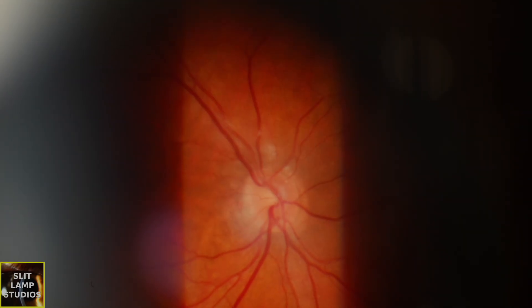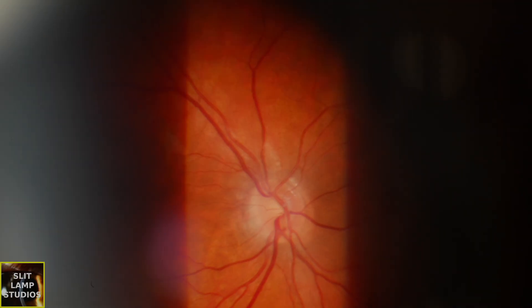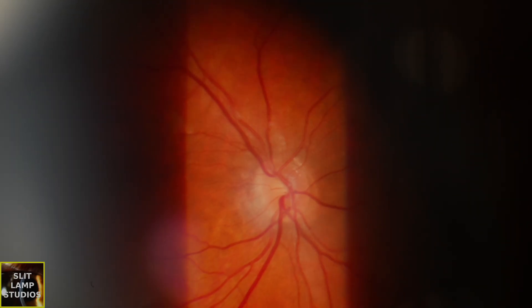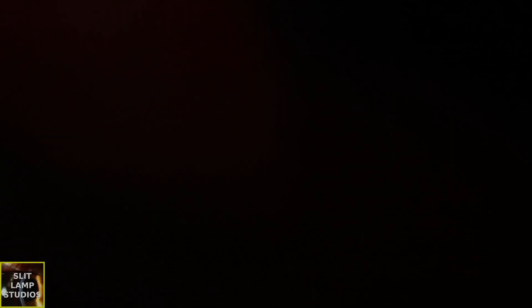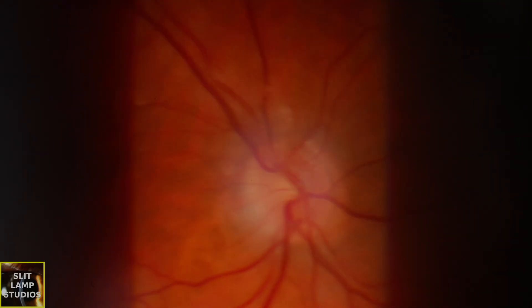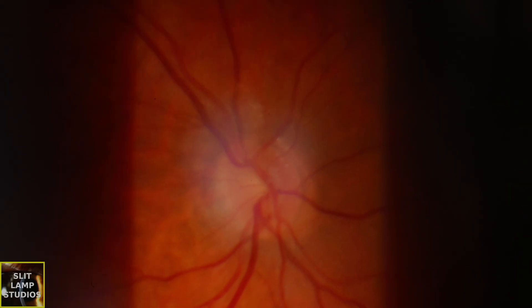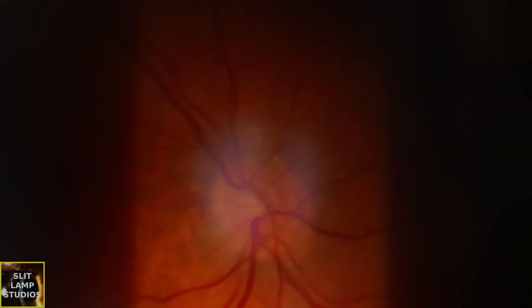So don't put too much weight on this. Hopefully you can see that just right in the central part of the optic nerve, the calibre of that vessel is changing. So when you do see that, be aware of it. Bear this in mind — have a look at this finding and let me know what you think of this video.